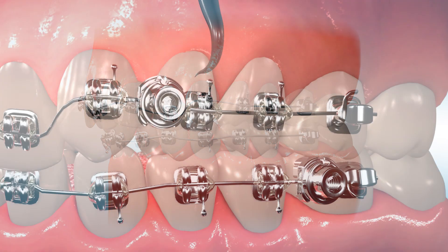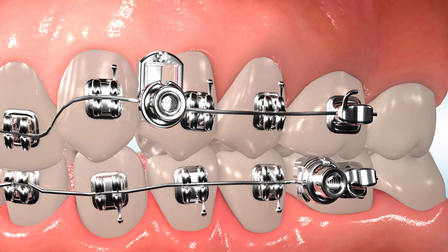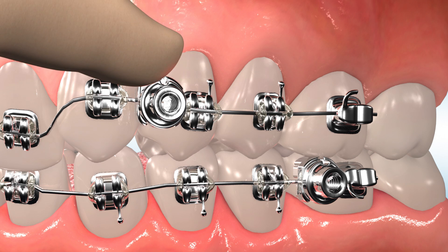The self-ligating door slides up and locks into the open position using the provided tool. Once the pivot is placed on the arch wire, a simple finger push closes the door to secure.